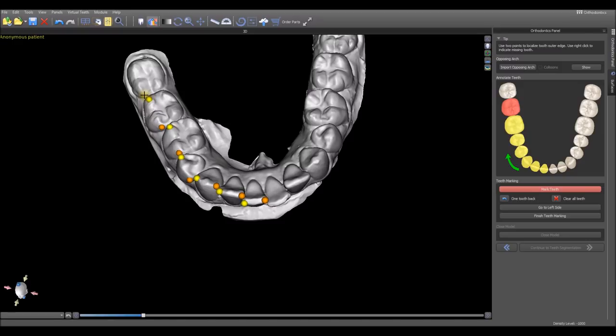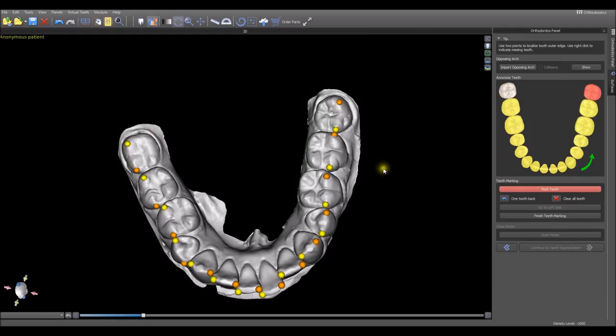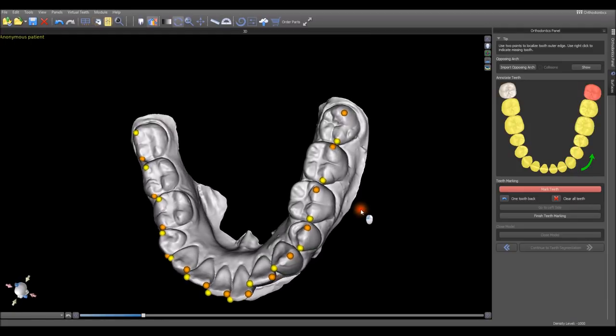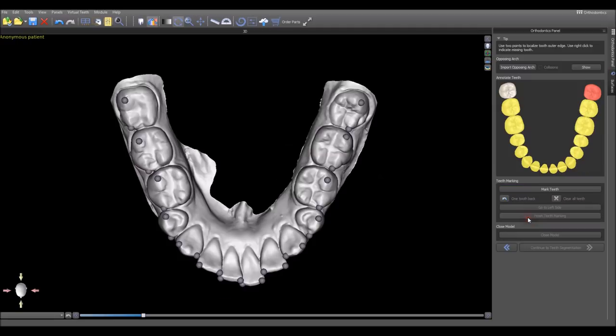You want to start on the right side of the arch. After you've marked the right side, click Go to the left side and continue marking the left side. Once the teeth are marked, we click Finish Teeth Marking.